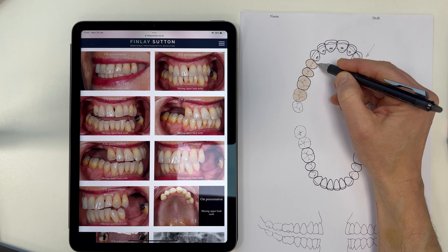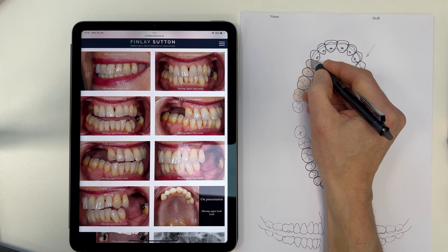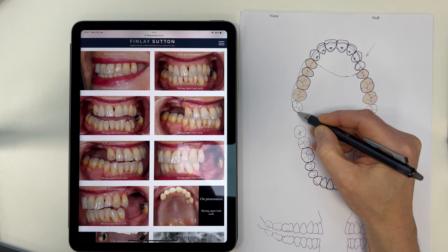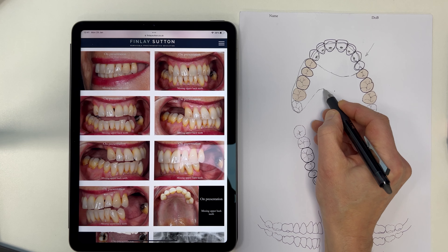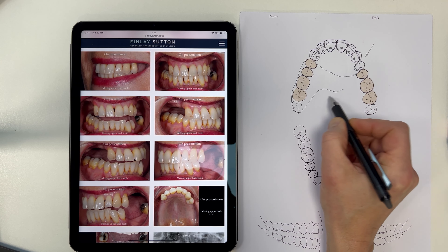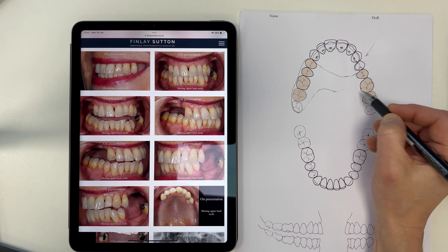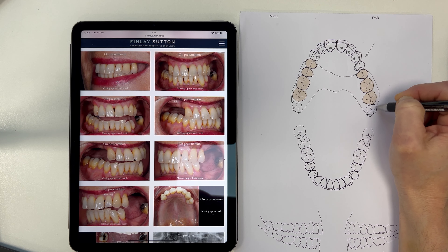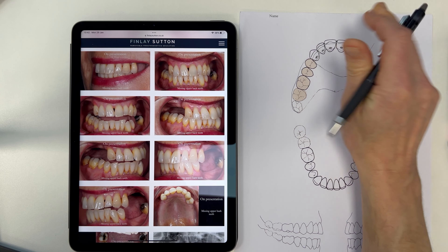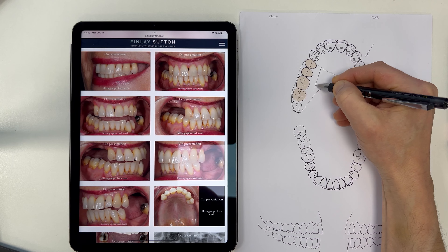So I'm going to just bring that right across there like this. These saddles I want to just extend fully around the back of the tuberosity just there. This is going to be the centre line, so I just mark that on there. I'm going to sweep this further forward and just bring it back with a little sweep — if we look at the hard palate underneath the bone itself comes back like that. I'm bringing this further forward but it just looks nicer with that little sweep back, then bring it round fully around the tuberosities.